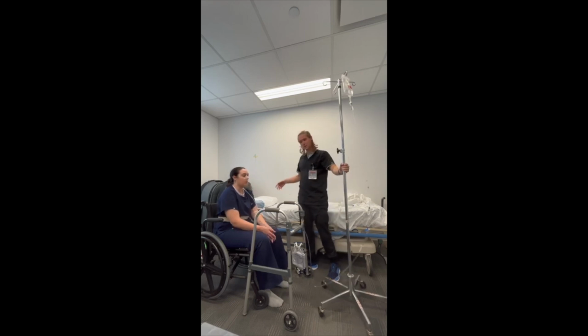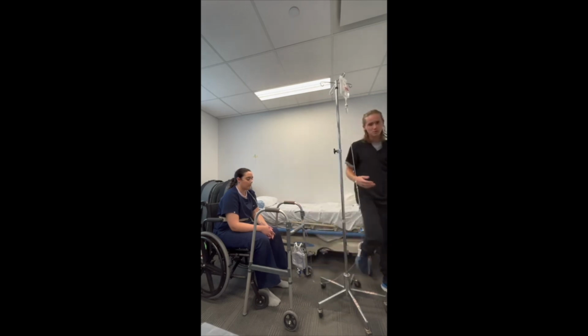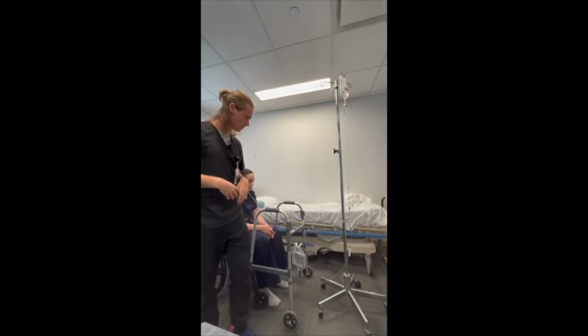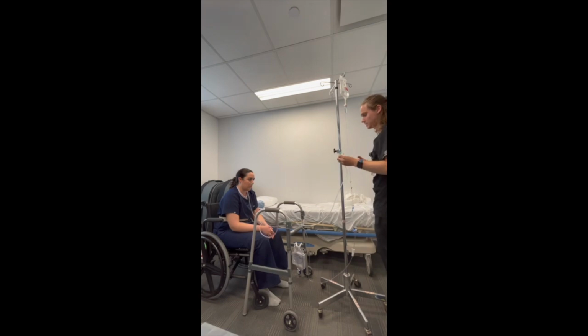And then one more thing we've got to keep an eye on before getting up and walking is that our oxygen is still connected to the wall, and that's not going to give us a lot of room to walk. So in this case, we're going to bring an oxygen tank in, and we're going to carry that with us. We don't have one right now, but we're going to demonstrate the skill anyways. You want to make sure you're not wrapping this around the patient in any way that's going to decrease the range that you have or cause any discomfort.